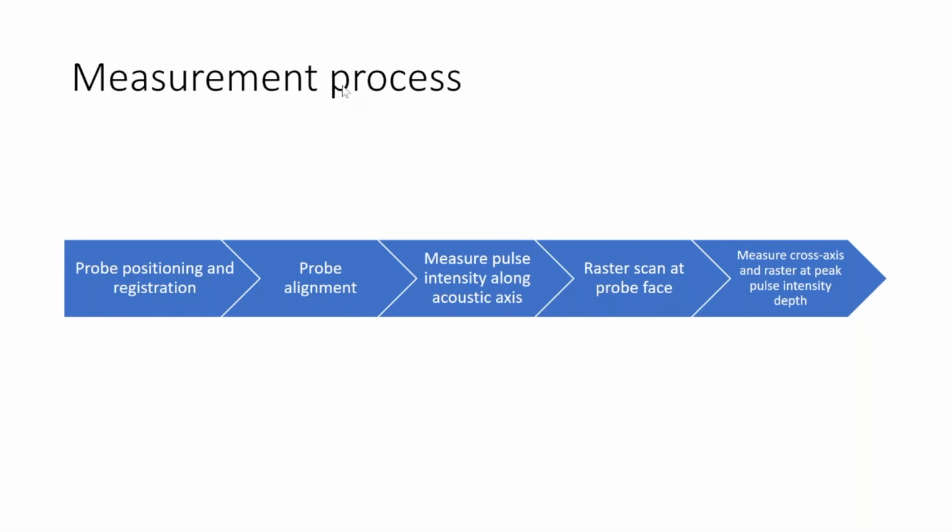That's a very interesting question, but to this point, all utilization of shear wave elastography has been commercialized in systems that are, at least for the US FDA, track 3 submissions. And so the next question is, I found most manufacturers don't require ongoing testing. Do these parameters change as the machine ages over time?